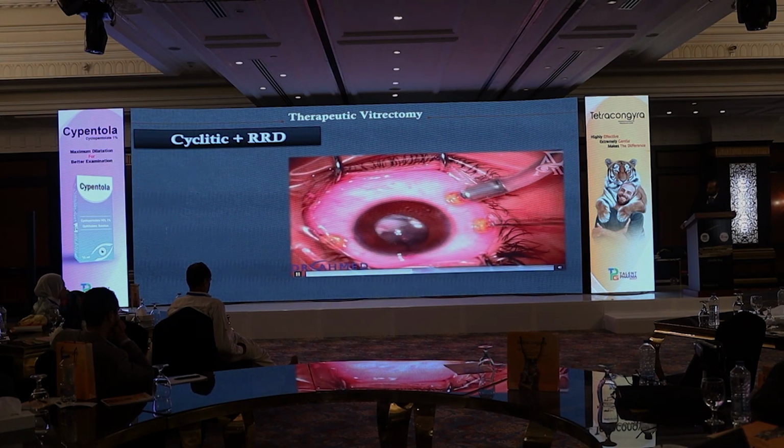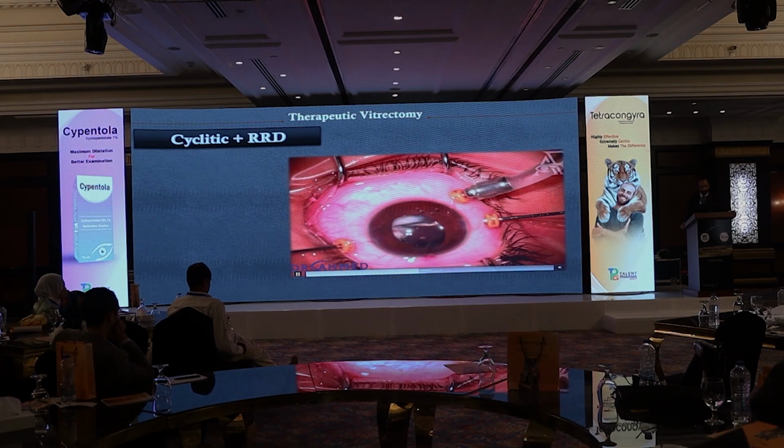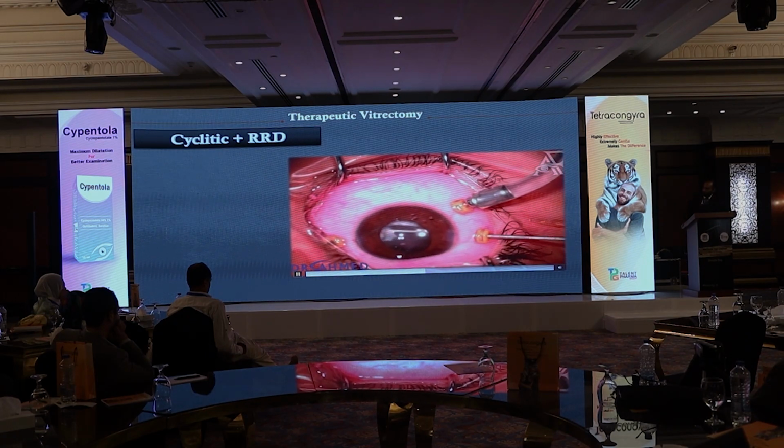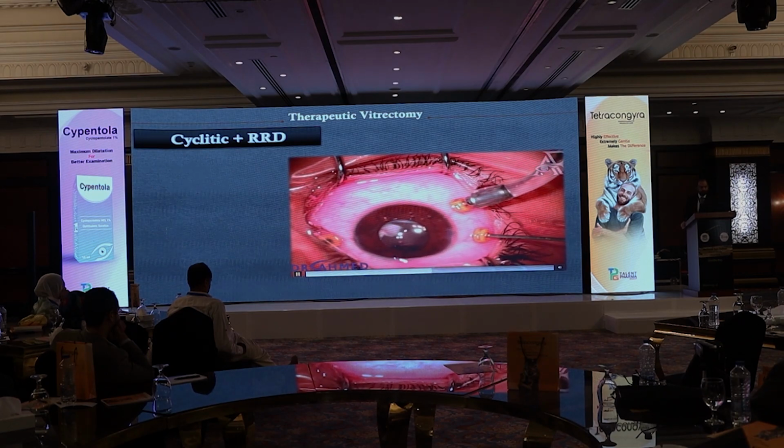In intermediate uveitis, when the membrane forms around the ciliary body, it's really mandatory to remove as much as you can, or segment it at least, because the pulling power of it will cause the patient to go into atrophia bulbi after that. So at least try to segment it.